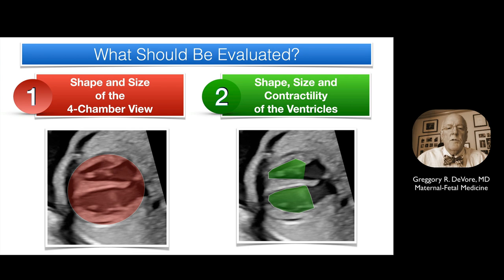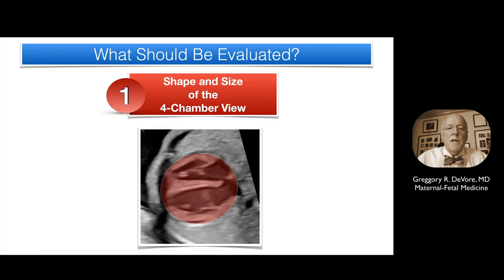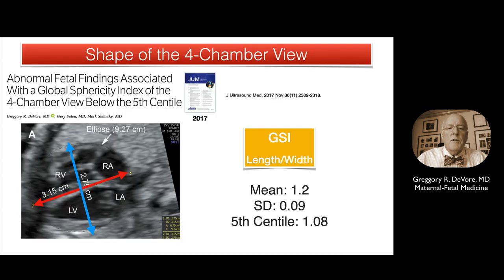The measurements of the heart that would be important to consider include first the shape and size of the four-chamber view, followed by the shape, size, and contractility of the ventricles. The shape of the four-chamber view can be computed by identifying the end-diastolic frame. Two measurements are made: the basal-apical length in red, and the transverse width in blue. The term used to describe this shape is the Global Sphericity Index, or GSI, computed by dividing the length by the width. The mean value is 1.2 with a standard deviation of 0.09. The fifth centile is 1.08, and any value less than 1.08 is considered a round or globular-shaped heart.